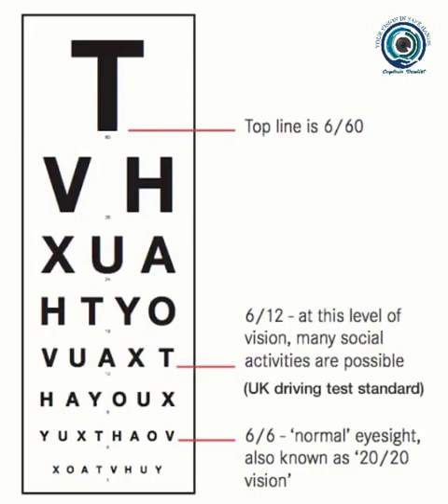The Snellen test type consists of a series of black letters arranged on a white board, which progressively diminish in size. Each letter is designed to fit in a square, and the vision is recorded as 6 by 60, 6 by 36, 6 by 24, 6 by 12, 6 by 9, and 6 by 6.